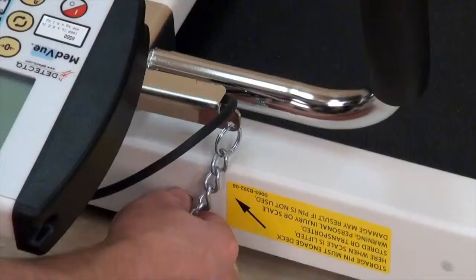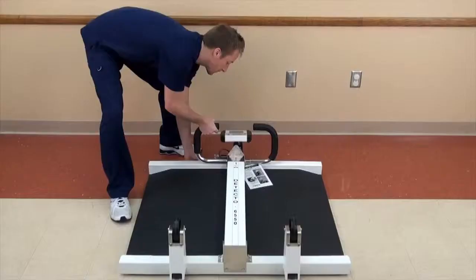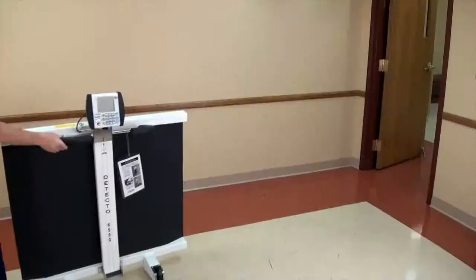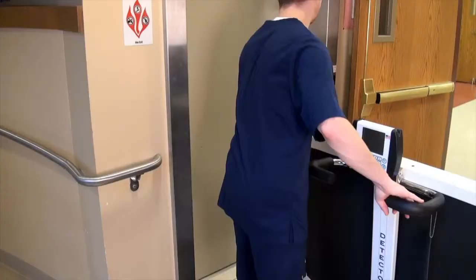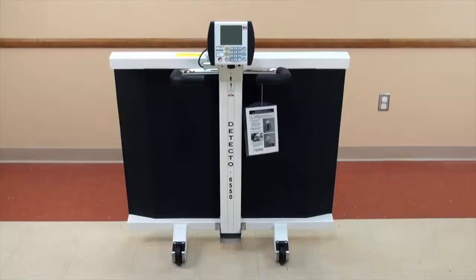To ready for transport, release the column and gently lower it to the base. Be sure to insert the storage pin to lock the column in place. The 6550 is equipped with dual wheels capable of movement in two directions for extremely easy transport. The scale may be pushed forward down a hall, pulled backwards onto an elevator, or rolled sideways into tight or narrow spaces.